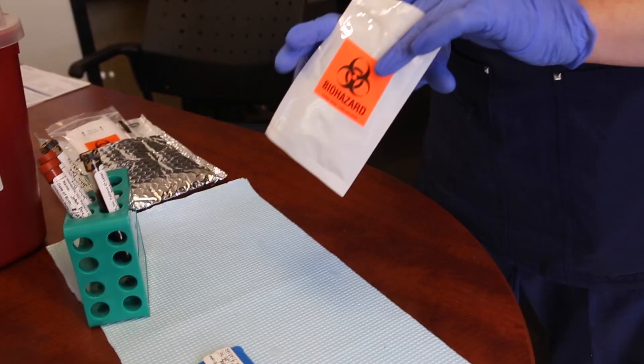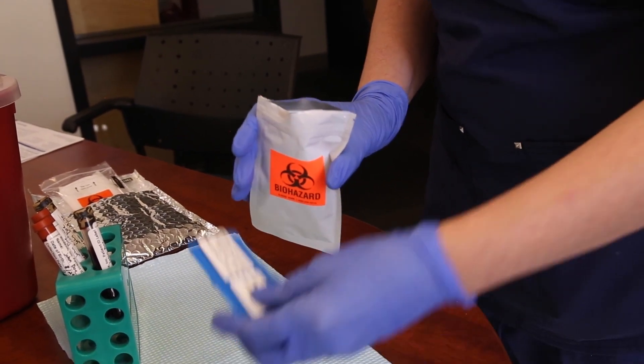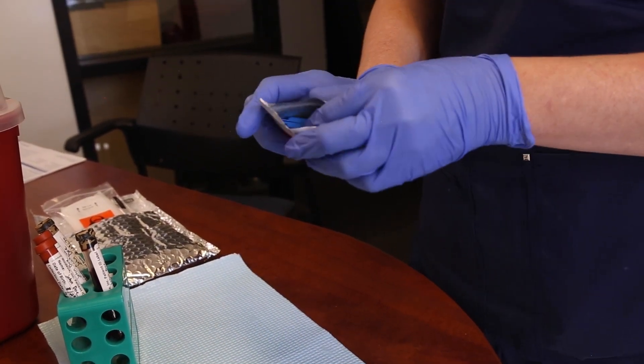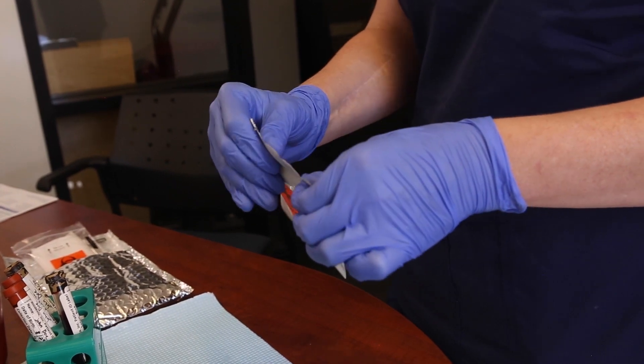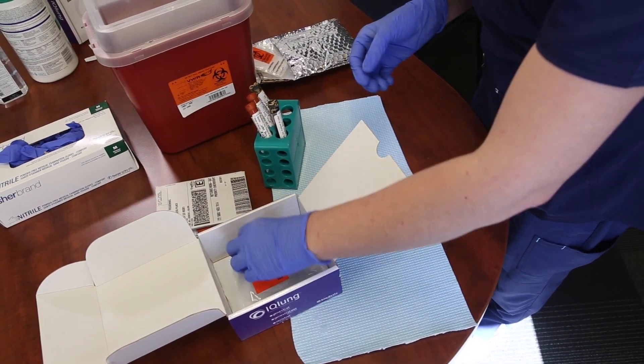Close the device and ensure the completed patient ID label is attached. Place the device back into the foil biohazard pouch and seal. Then place it into the kit box.